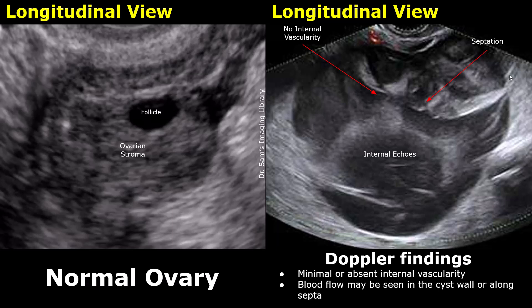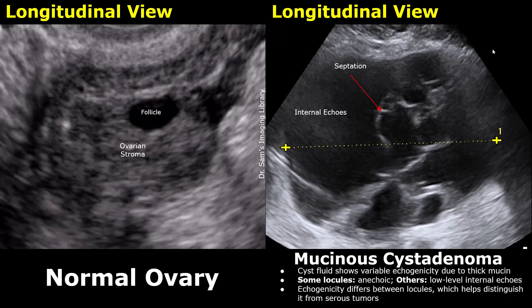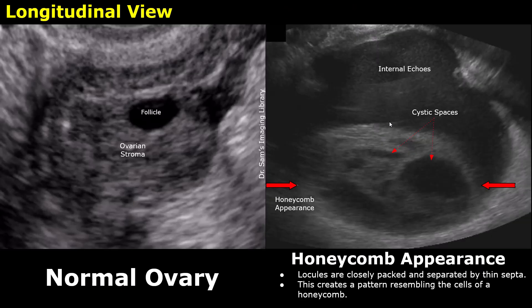Let's look at a few more images of mucinous cystadenoma. This cystic mass is multi-loculated and has internal echoes, although some locules appear anechoic. Some locules are closely packed and separated by thin septations, so they may create a honeycomb pattern. This locule has low-level internal echoes. This was a mucinous cystadenoma.